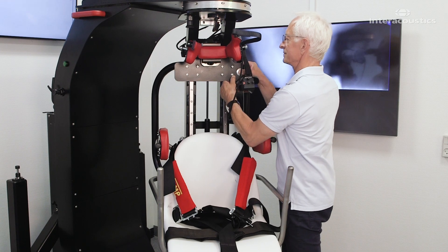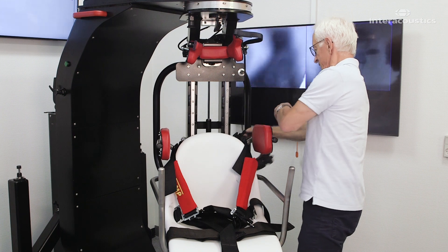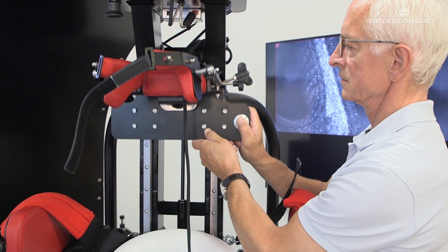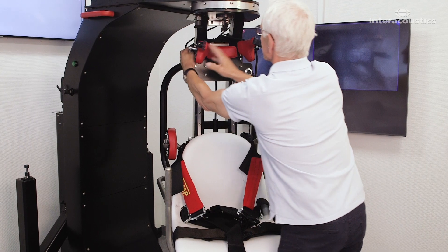Before seating the patient in the TRV chair, you must prepare all cushions, straps and surfaces. First, raise the head support to the highest position, then open the upper cushion gaps.